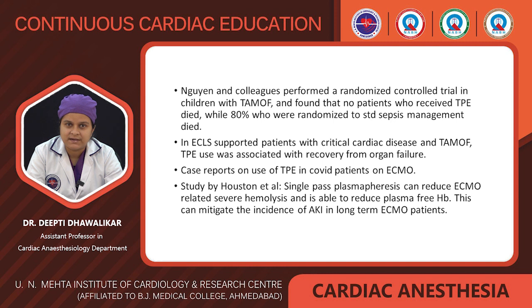Study by Houston et al. They concluded that single pass plasmapheresis can reduce the ECMO-related severe hemolysis and is able to reduce plasma-free hemoglobin. This in turn can also mitigate the incidence of AKI in long-term ECMO patients.